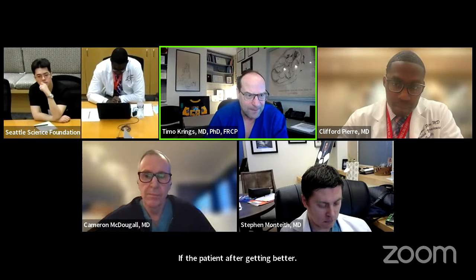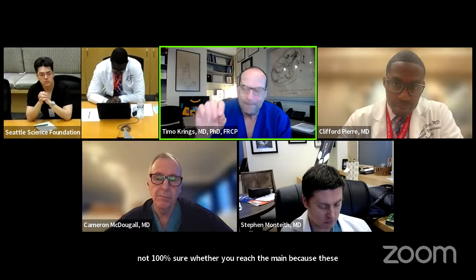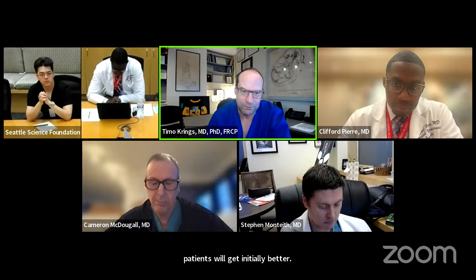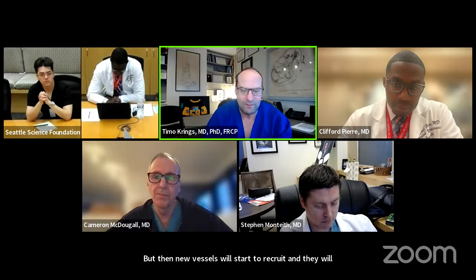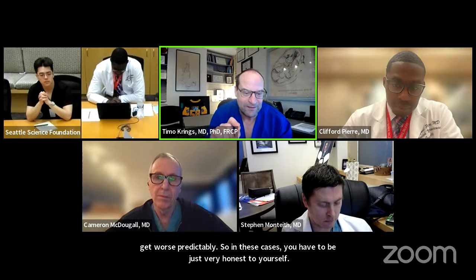That, I think, is the major point to look after, especially if you have done an embolization and you're not 100% sure whether you reached the vein, because these patients will get initially better, but then new vessels will start to recruit and they will get worse predictably. So in these cases, you have to be very honest with yourself. Do a CT, and if you see that the glue or the Onyx is not in the vein, this patient will deteriorate, and those have to be treated early on.